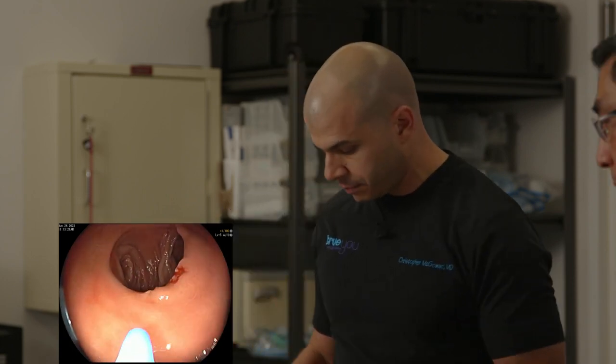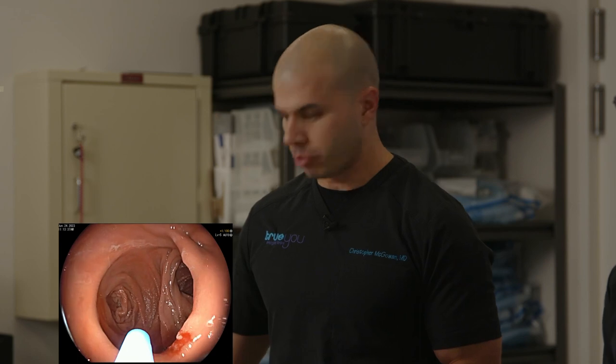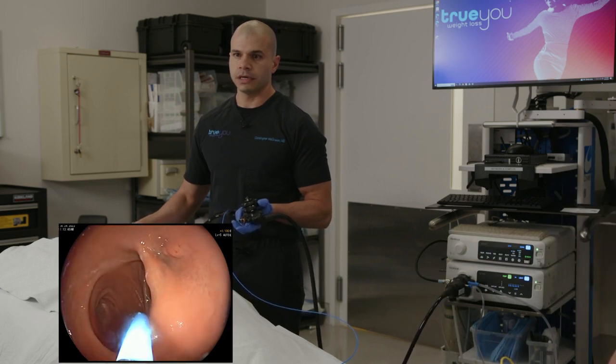Now I'm controlling this with a foot pedal, and I have this set to a pretty high wattage. Generally, we'll use between 60 and 80 watts on forced APC mode. We really want to aggressively treat this, and we're going to treat it to a very dark brown color. So you'll see that process, and I'm just going to work my way around the anastomosis here. Cauterizing as we go.